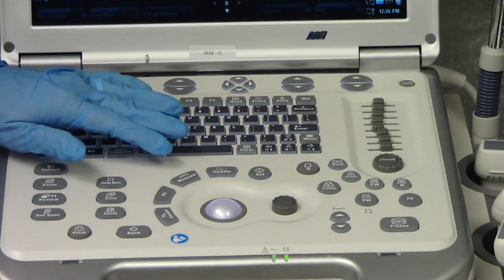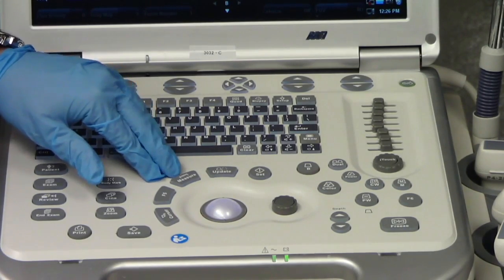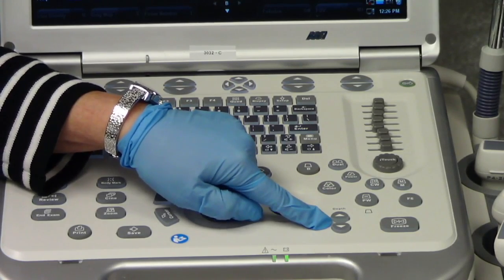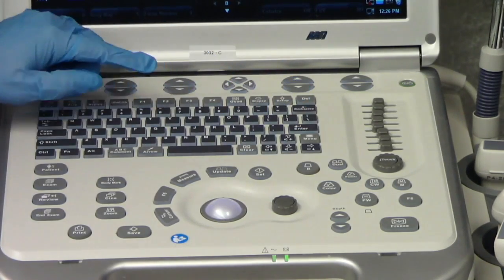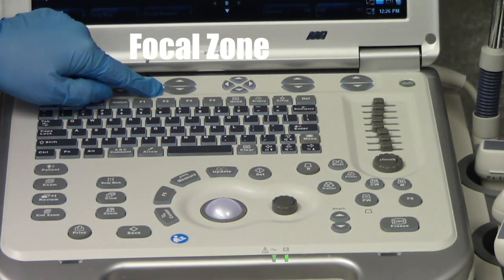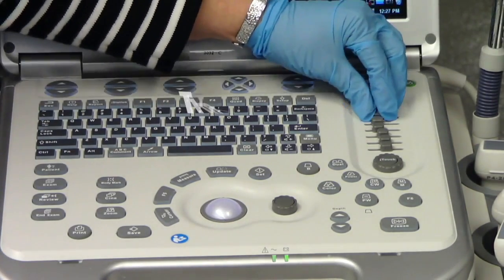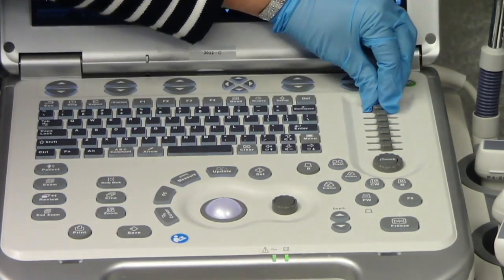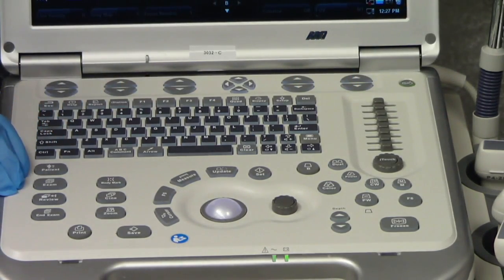Also remember, if we look at our machine, that the preset is going to already set a certain depth for you. Here are your depth buttons. So you don't need to touch those initially. It's going to already set a default for your gain, so you don't need to set that initially. And also for your focal zone. So keep those just the way they are until you begin to scan. In addition, the TGC should be set central, and I'm going to just slide these in the center of their slide. And this is all set up for before you begin scanning. You can start to adjust these once you start scanning.